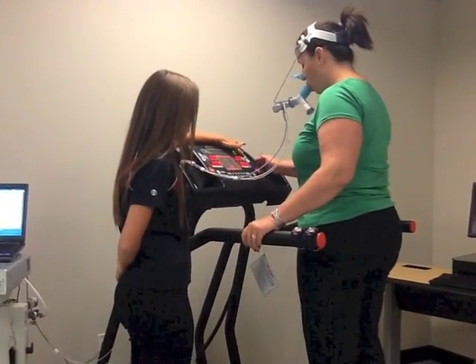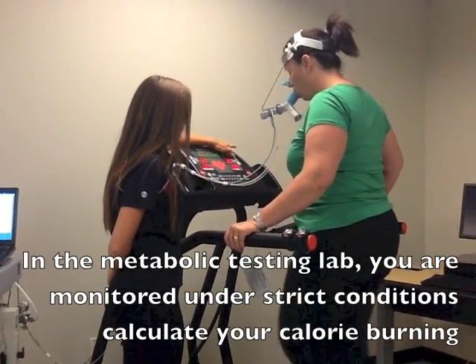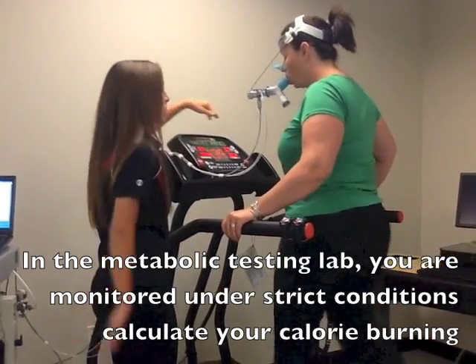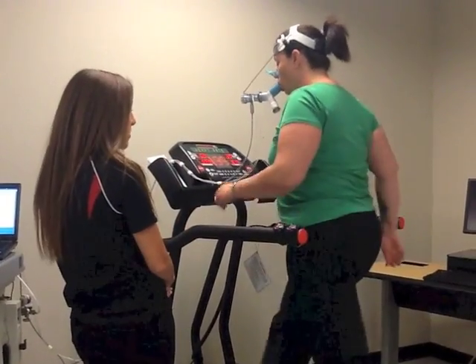We're going to increase the speed now to three miles per hour. We'll have you walk for just a couple minutes so the machine warms up and you get accustomed to breathing with a mask as well.